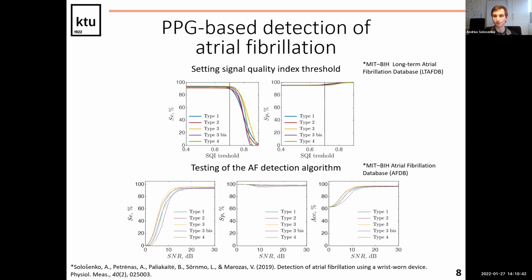So yeah, we were able to see how our model or how our algorithm performs during various types of noises. I'll note that the noise here was also synthetic, but it was acquired by using that same model, and then we used adaptive filters to extract the artifact from the real PPGs and use system identification to then use that kind of noise and add it in PPGs. So it's quite realistic, but still it was stationary.